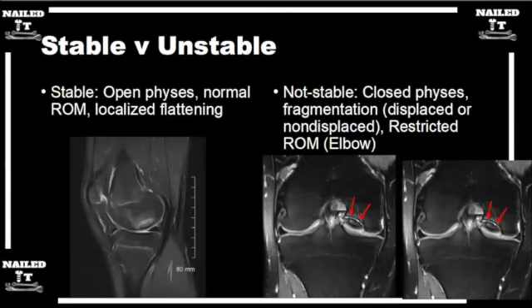And so the stable lesion is one where there's not going to be a significant amount of subchondral edema, or in some cases even fluid beneath the articular surface or beneath the subchondral portion of the OCD fragment. If you start to see a pretty well circumscribed area below the defect, or even, the buzzword that they often say on the boards or the OITE, fragmentation.